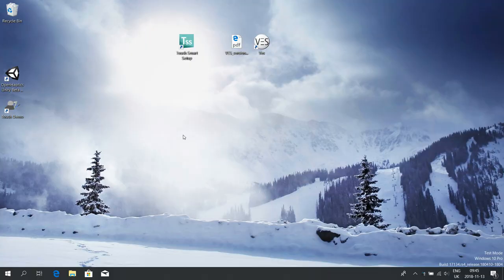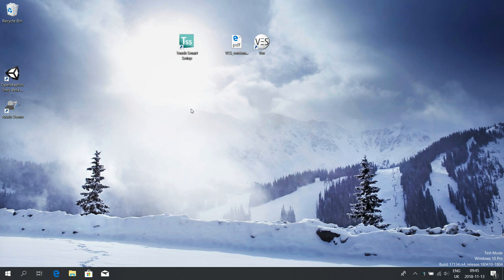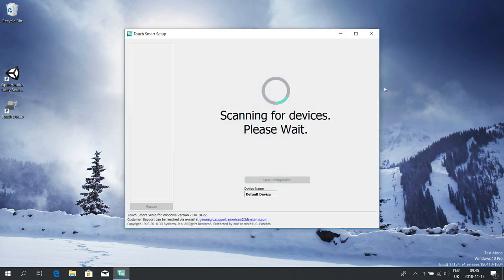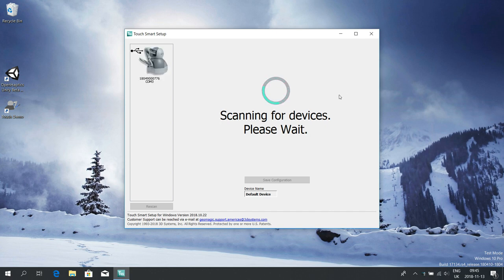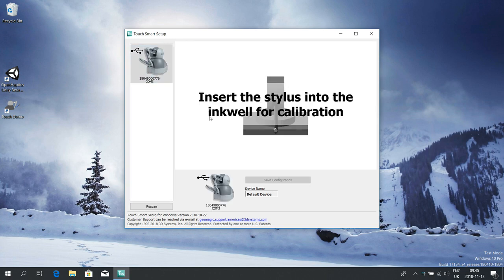So now I'm going to show you how to set up the haptic device. Your installation comes with the software called Touch Smart Setup, so simply click on that. Make sure the haptic device is connected via USB and powered up, and this scanning procedure will make sure the computer finds the device.